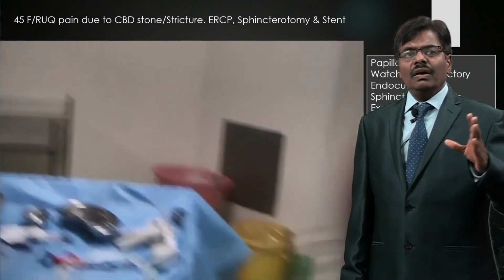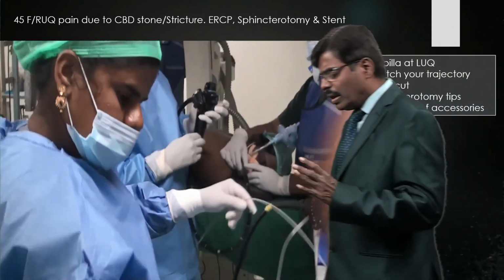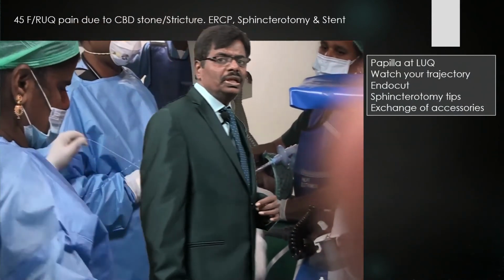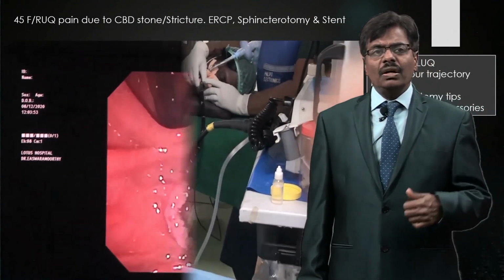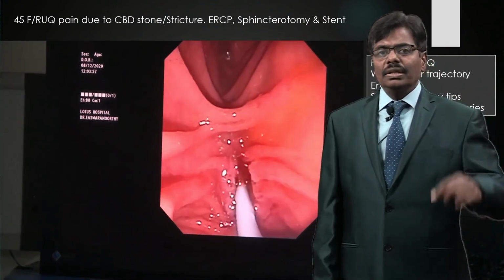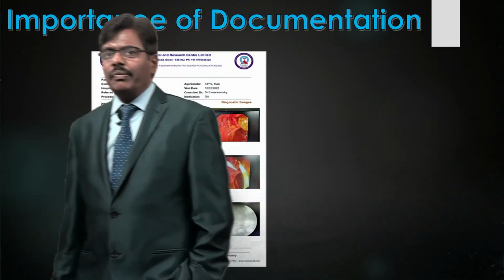And once we have done, all the exchange has to be done. See, always you have to have constant communication with your staff nurse. That's what I am trying to do here. She is trying to do what we call railroading. She also needs a lot of teaching, and we are just putting the stent. As I said, the single pigtail stent has been placed now.